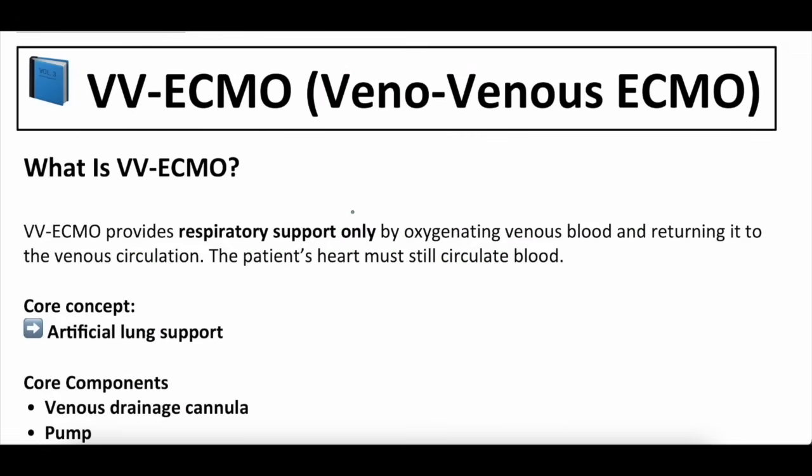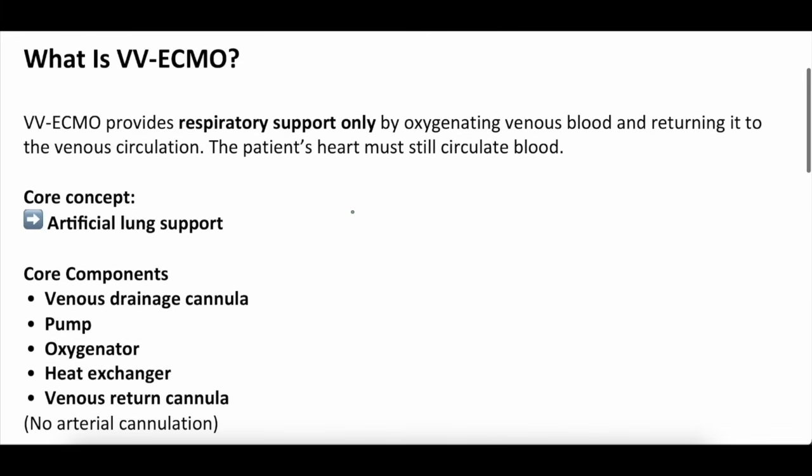Those of you that know us know we sometimes get lost in rabbit holes, but we're going to try to avoid that today. If you are craving more VV-ECMO knowledge after this, just search Whiteboard Medicine ECMO or extracorporeal membrane oxygenation. We got a whole bunch of episodes on ECMO and all things mechanical circulatory support, LVADs, balloon pumps, etc. But this is going to try to be kind of a foundational principles of how VV-ECMO works in under 10 minutes. So let's go.